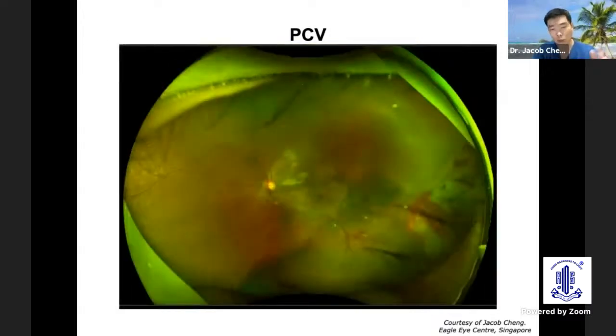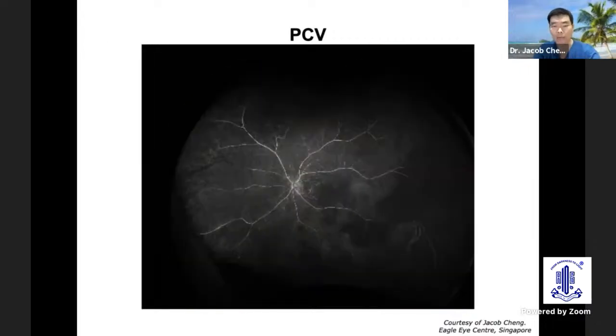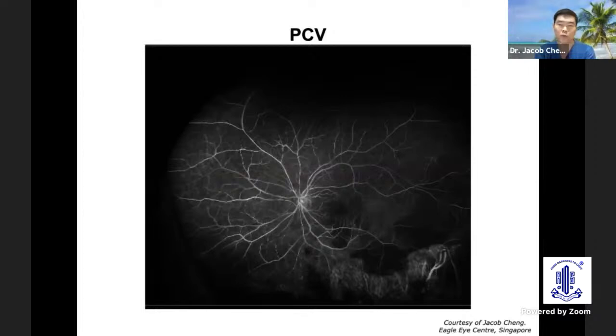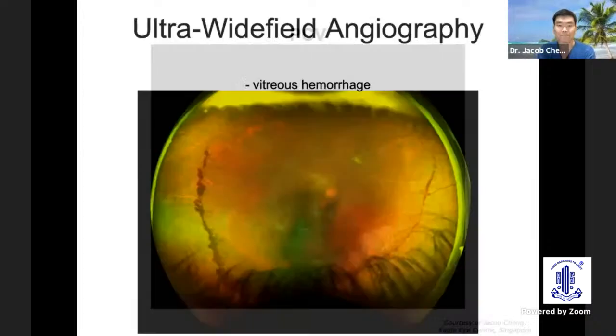So here we can document the slow resolution of the hemorrhages, and we can more or less confirm in the fluorescein angiogram part. However, we do know that PCV is an ICG diagnosis. However, this patient was allergic to ICG. I could only document some leakages in the periphery with the fluorescein angiogram.